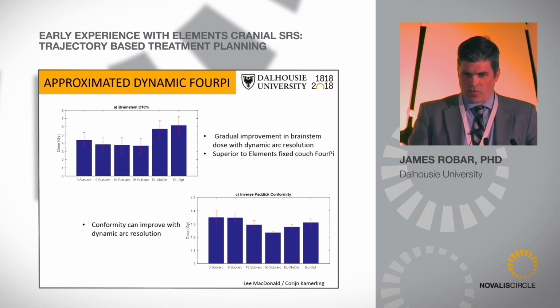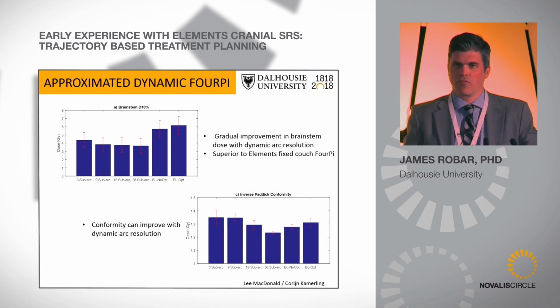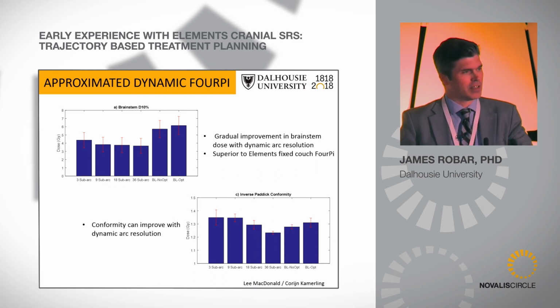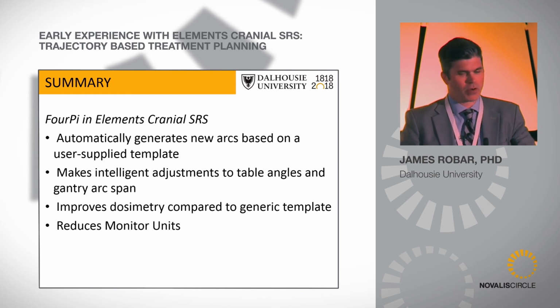So I'm going to summarize very briefly. It's really great to have been working on a project and to actually see some of that innovation, in around 15 months, reach the product and start to reach patients. Elements, I think one of the benefits will be the automation, and encouraging the uniformity of plan quality through automation.